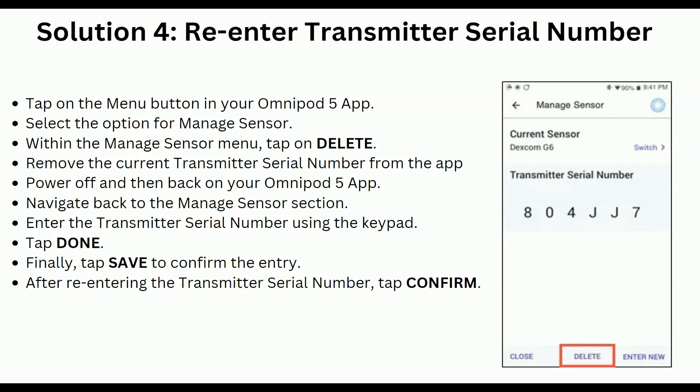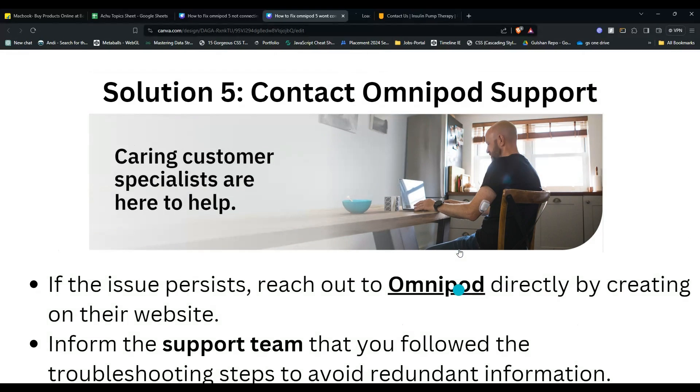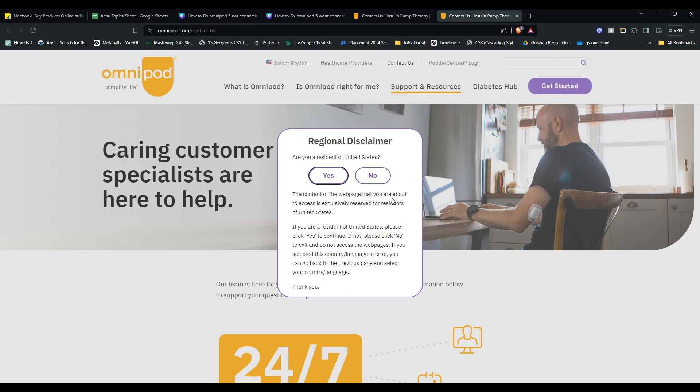Navigate back to the Manage Sensor section and enter the transmitter serial number using the keypad, then tap Done. Finally, tap Save to confirm the entry. After re-entering the transmitter serial number, tap Confirm.